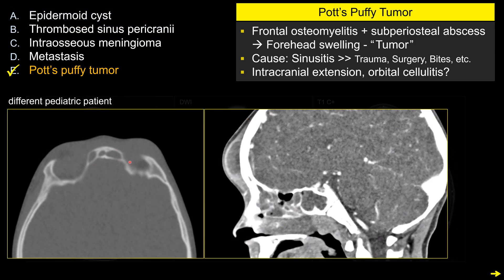This is a different patient. On CT, there is complete opacification of the frontal sinus, swelling of the anterior soft tissue, as well as soft tissue adjacent to the orbit. On the post-contrast sagittal view, you can see a large subperiosteal abscess and a smaller epidural abscess, just like our patient. Notice there is severe sinus disease, including complete opacification of the sphenoid sinus. Importantly, you do not need complete bony destruction or frank bony dehiscence for infection to spread both anteriorly and posteriorly. On CT, just because you do not see bony erosion does not mean the patient does not have intracranial extension.